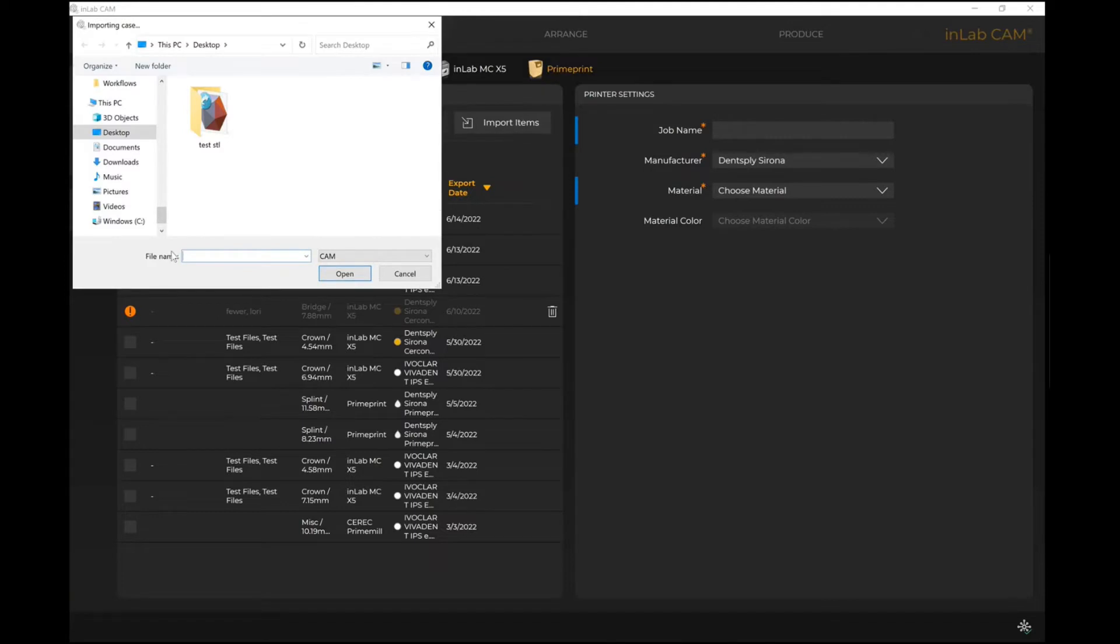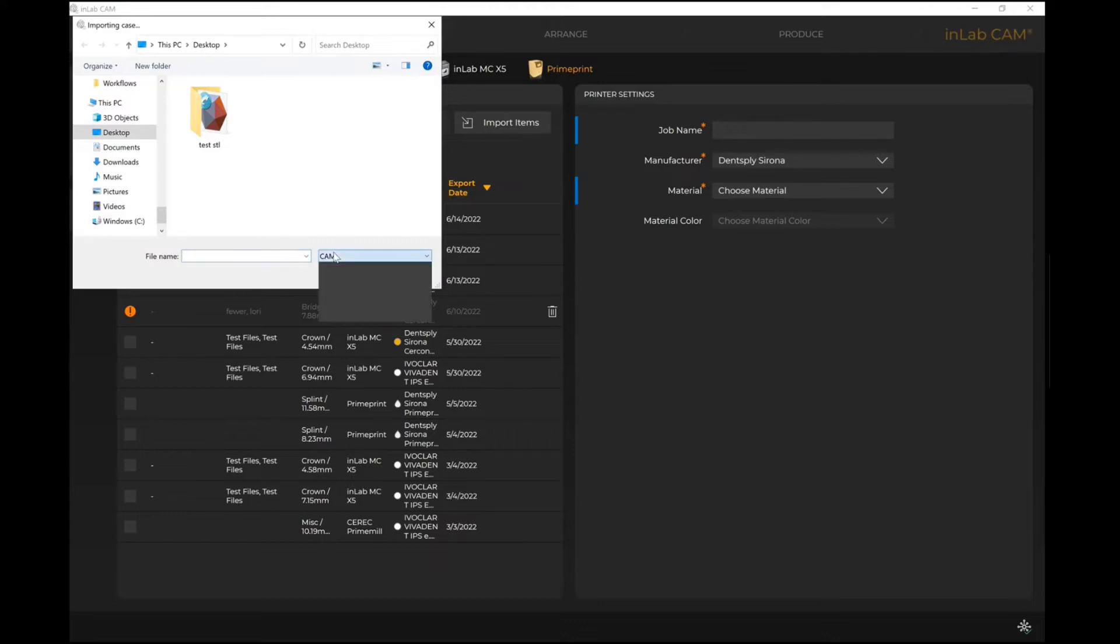I can find when I hit Import Items, this option will come up. If I'm looking for a CAM-specific file, that means it's an integrated file coming from inLab or Cerec. The CAM file would look as such. However, when you use this drop-down menu, you'll see there are a few other options.